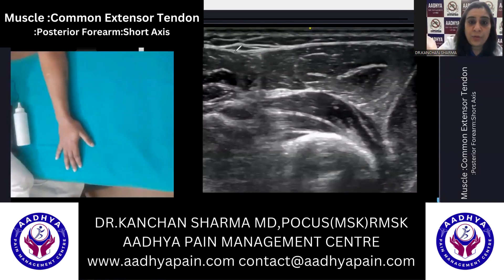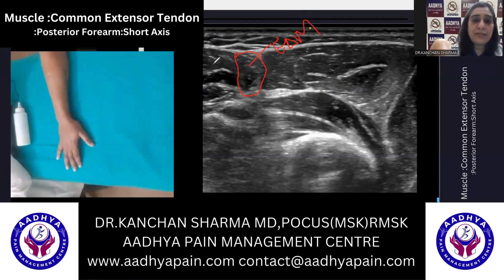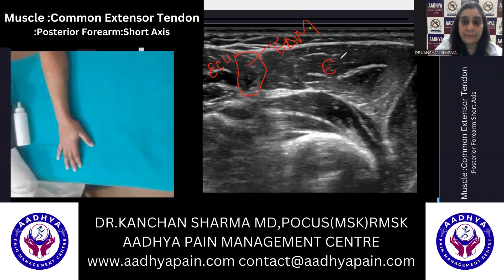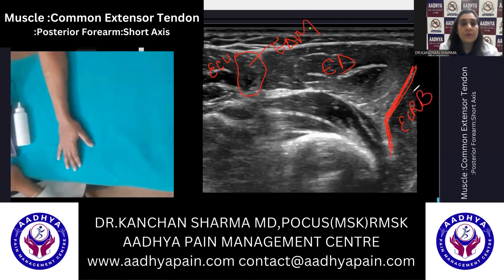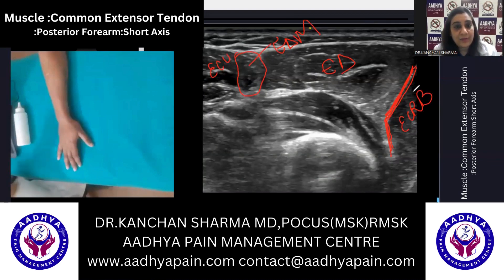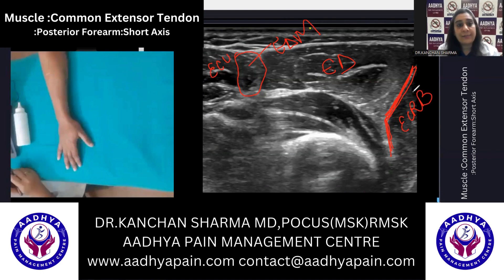What we have seen here is the extensor digiti minimi. On this side we have the extensor carpi ulnaris, then the extensor digitorum, and what you see here is basically the tendinous portion of the ECRB — extensor carpi radialis brevis. So you have ECU, extensor digiti minimi, extensor digitorum, and then ECRB.